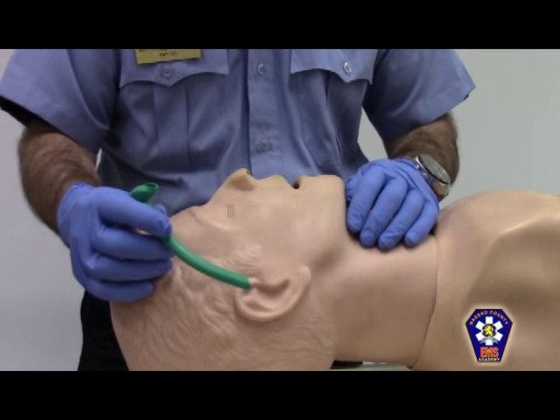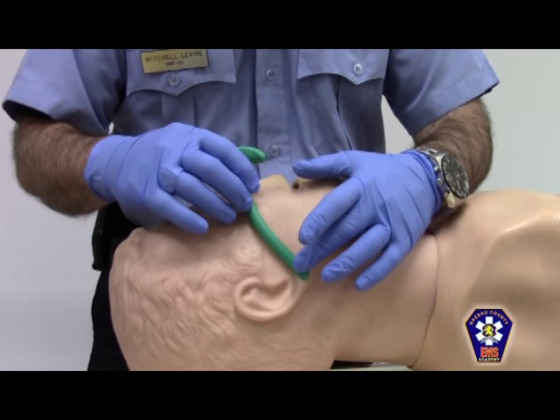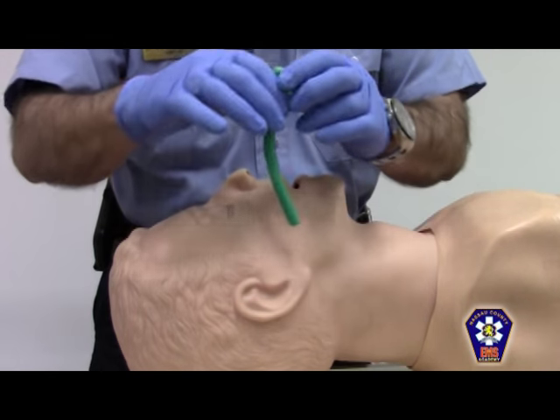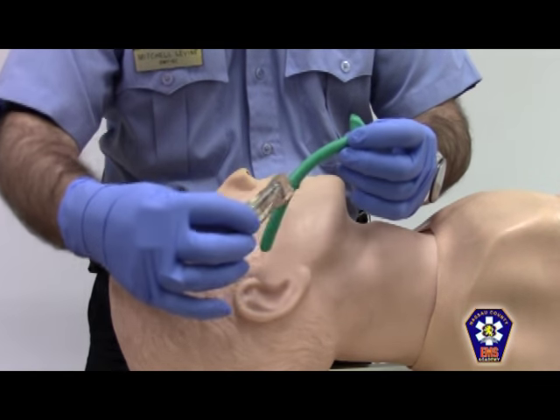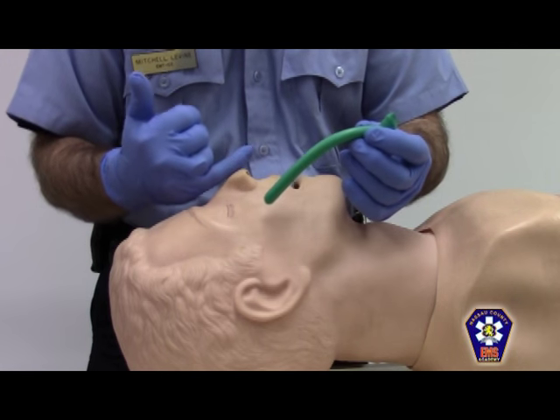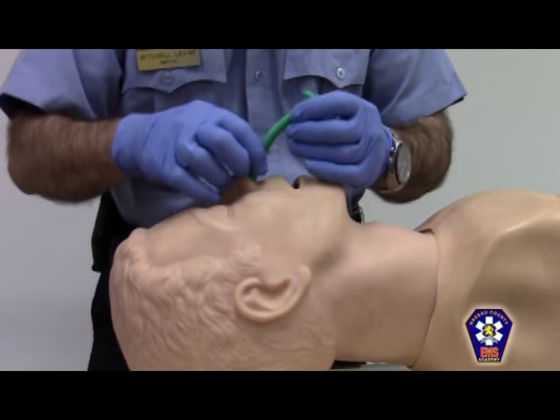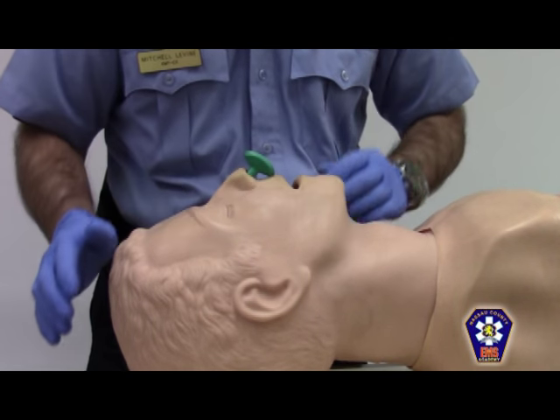Prior to inserting the nasopharyngeal airway, choose an airway that measures the same length as the distance between the patient's tip of the ear and the nostril. Lubricate the NPA with water-soluble gel. Insert the NPA with the bevel of the nasopharyngeal airway facing the patient's nasal septum. Gently insert the nasopharyngeal airway all the way in until it sits just right.